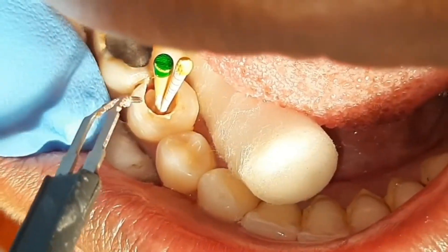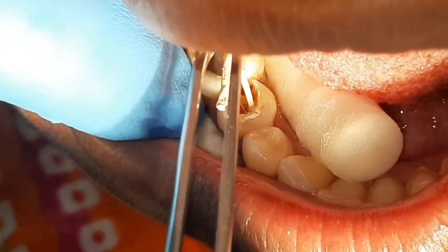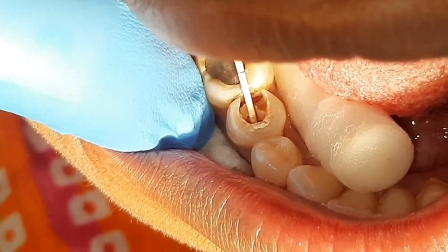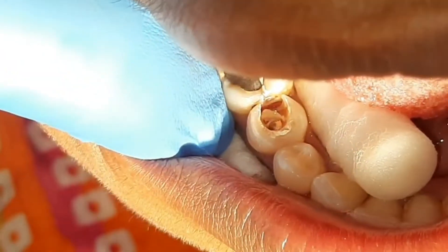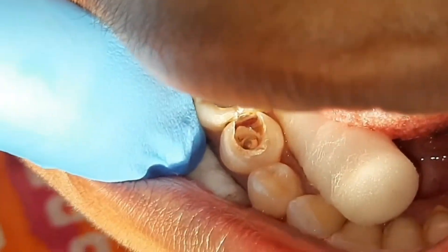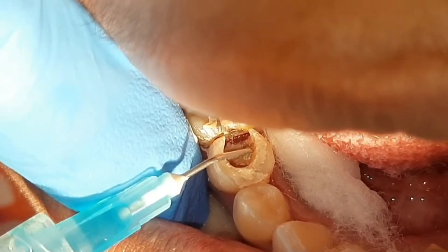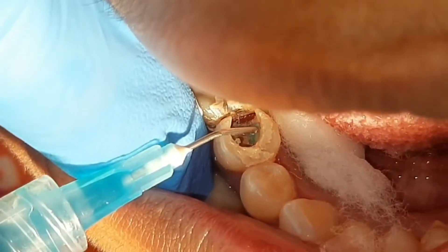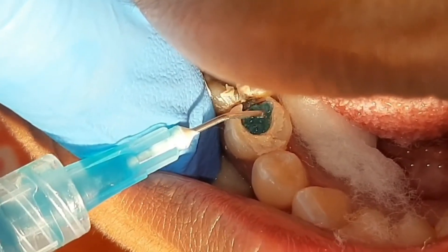Then seal it with a GP cutter or obturation pen. Apply etching to each surface for better bonding of the composite.